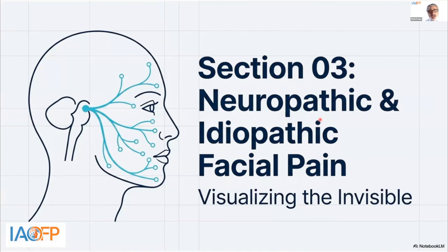So imaging, therefore, plays a supportive role, primarily to exclude any secondary cause of the pain, such as tumors, vascular compression or intracranial pathology. So here we focus on the use of imaging while recognizing its limitations in evaluating these often invisible pain conditions.